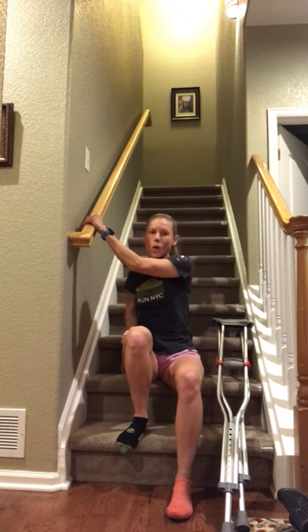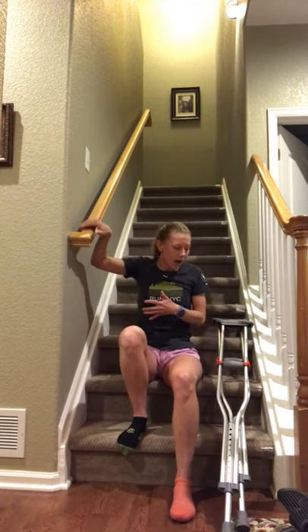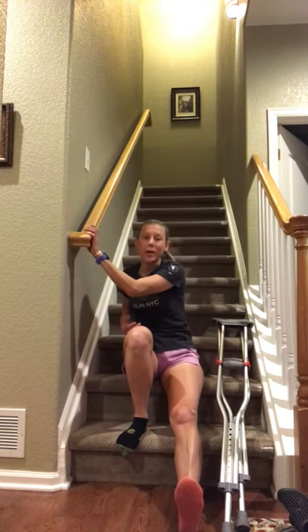In this video I'm going to review going up and down the stairs with one crutch — specifically using one handrail and using the crutch on the opposite side. Compared to using two crutches, this way is a lot safer, so anytime you have the chance of using a handrail, always opt for that. Obviously there are situations where you encounter a curb or stairs in the community that don't have handrails, but generally if there's a handrail available, always use it.